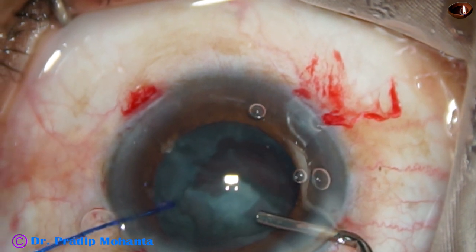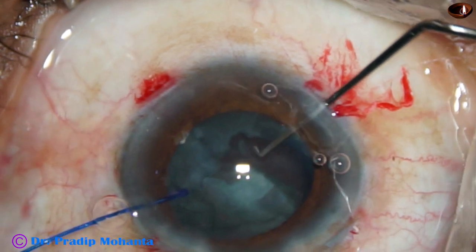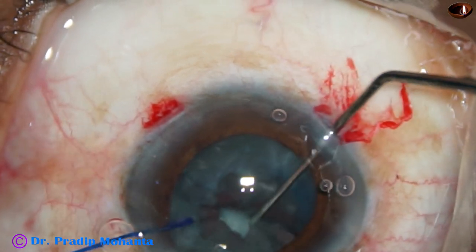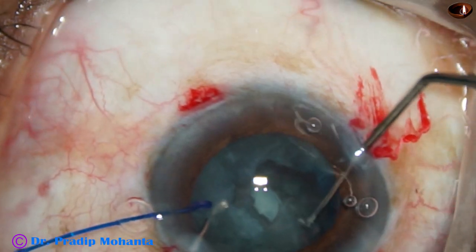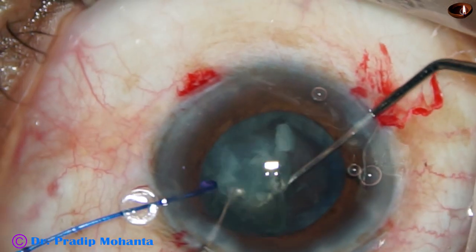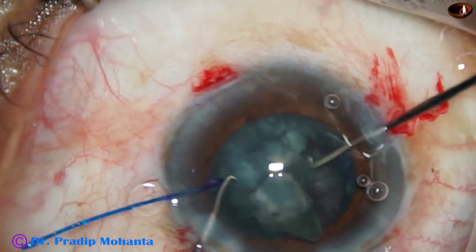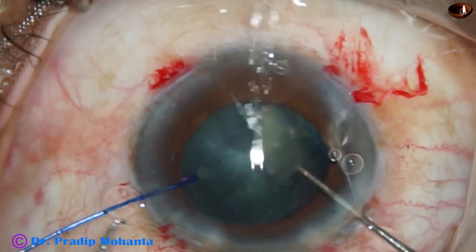This surgery took 52 minutes. I have edited it to about 22 minutes — if I edited it further, one cannot follow the surgery. So this is going to be a long video of 22 minutes. I am bringing out the other hemi-nucleus and dividing it into two fragments by the two hooks.